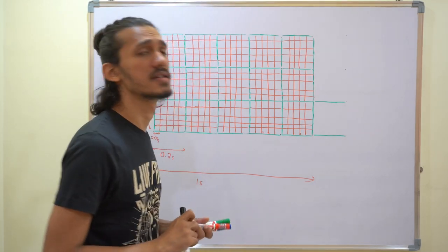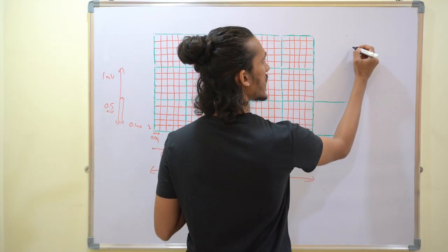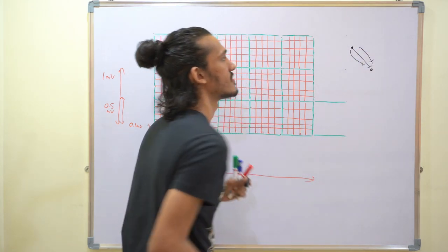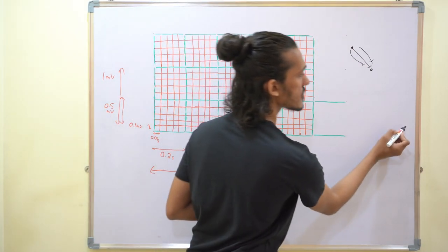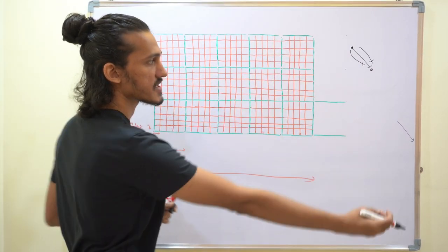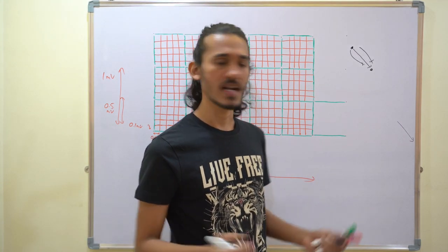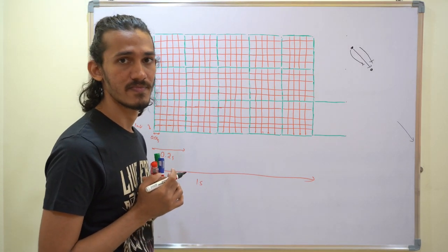So the first wave is the P wave, right? Initially from the SA node, impulses are going to the AV node, and the atria is getting depolarized. So this is the general direction, and this is the direction of your lead 2. Because it is generally moving towards the positive, anything moving towards the positive would be a positive deflection. So the P wave would be a positive deflection over here.